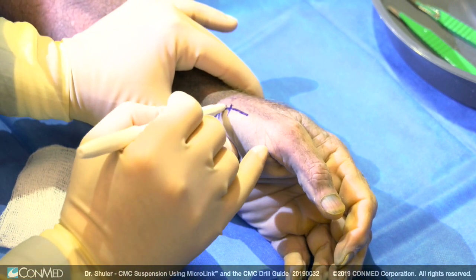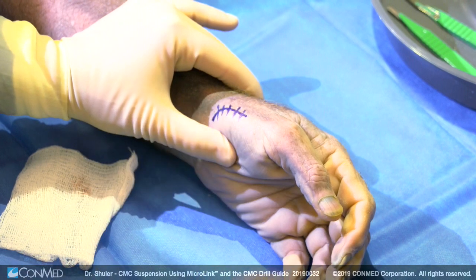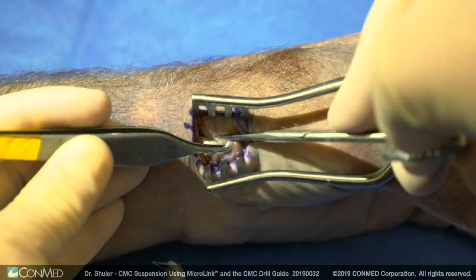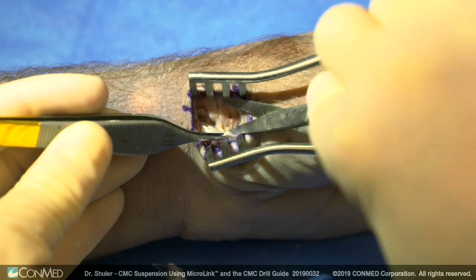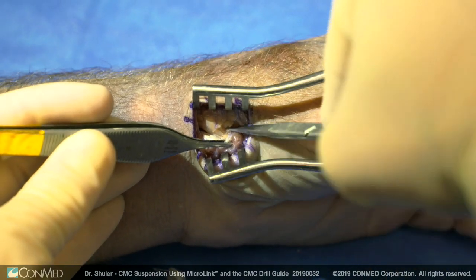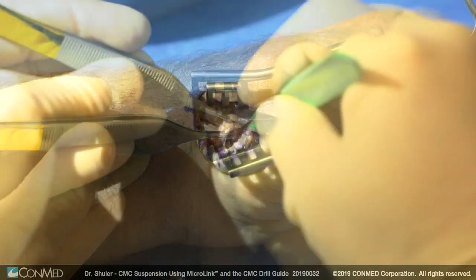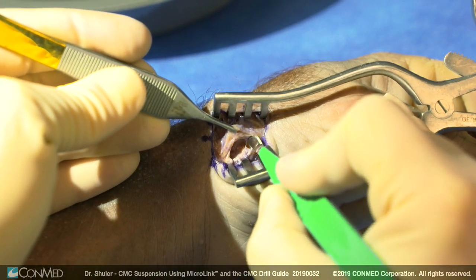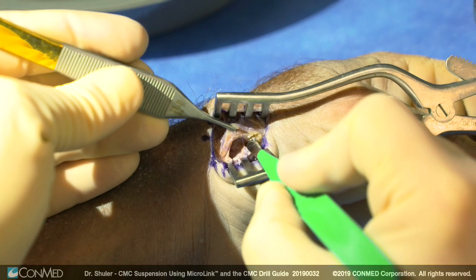The skin incision is made as a curvilinear incision along the glabrous skin edge where the hair stops on the palmar aspect of the hand. Sharp dissection is made down to the thenar musculature. The thenar musculature is peeled off the capsule, exposing the capsule, which is then incised longitudinally to expose the CMC joint. Sharp dissection is then made around the trapezium.